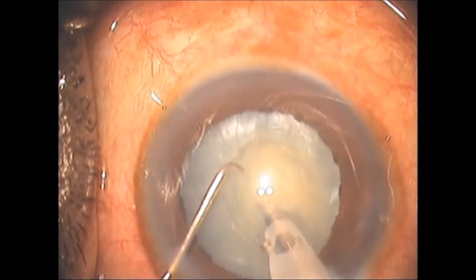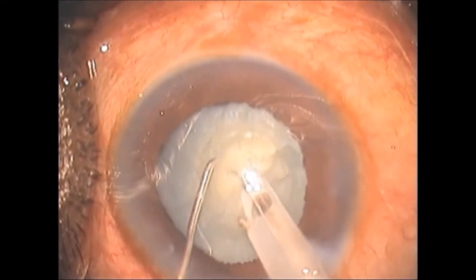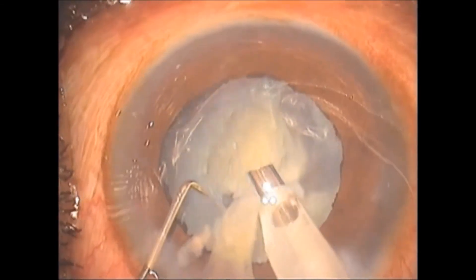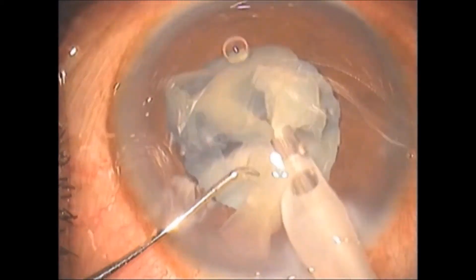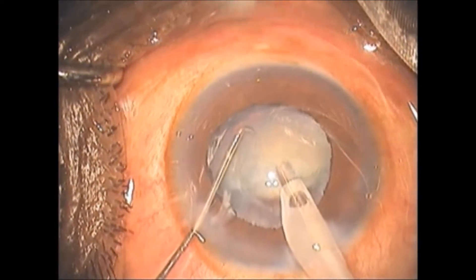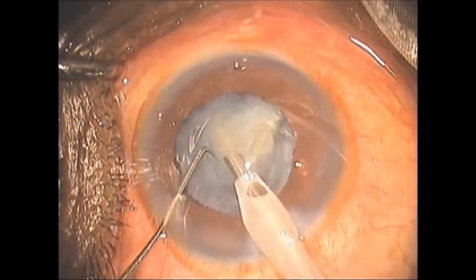In this case of a hard mature cataract, the modified direct chop technique comes in handy. In phaco burst mode with correct parameters and good AC stability, a modified direct chop with a sharp long-tip chopper is performed. The surgeon ensures the posterior plate cracks well before chopping into smaller pieces, which can be removed as they are chopped, giving more surgical space for the nucleus to move.